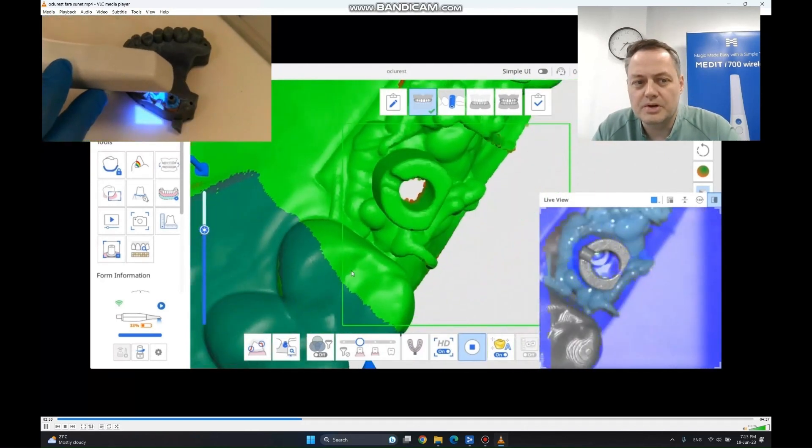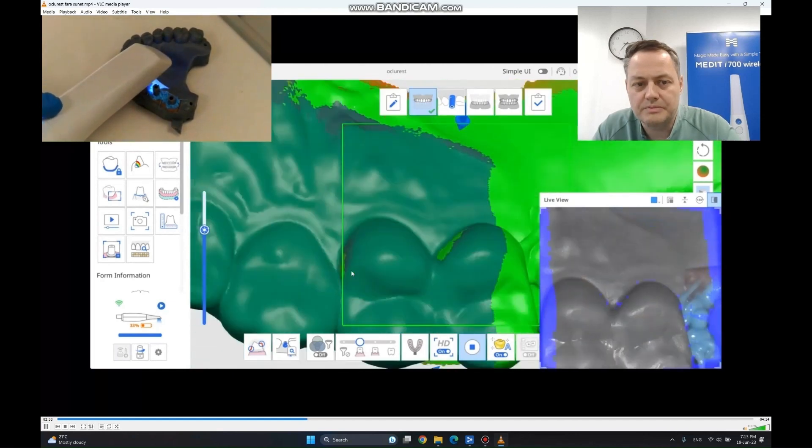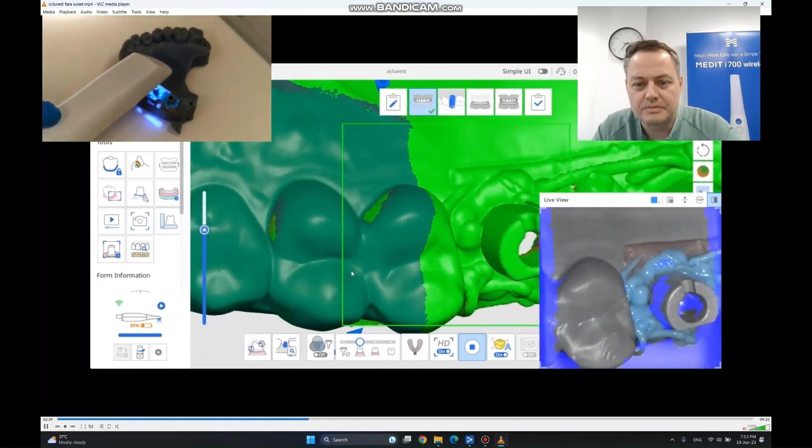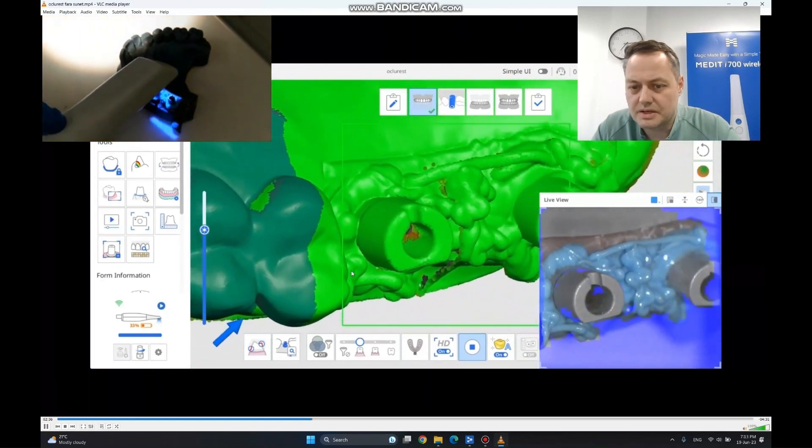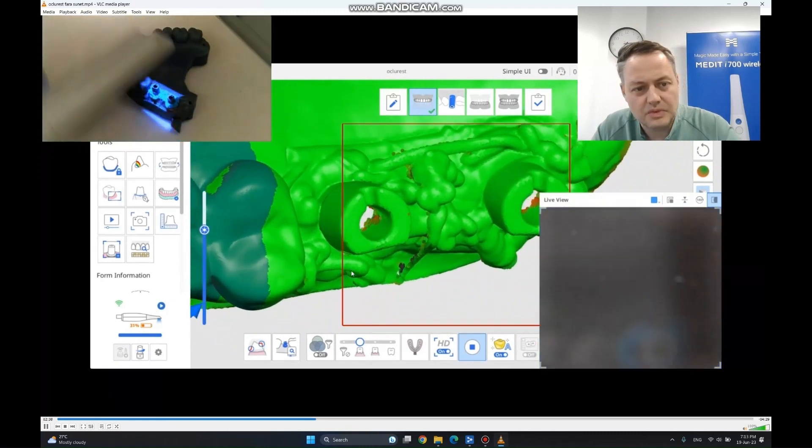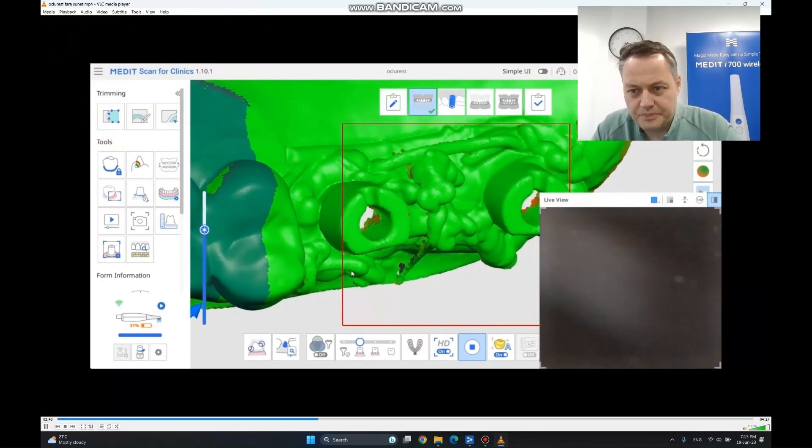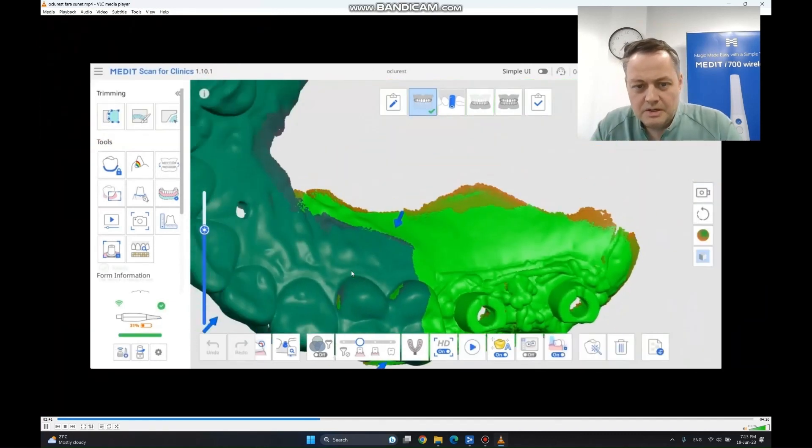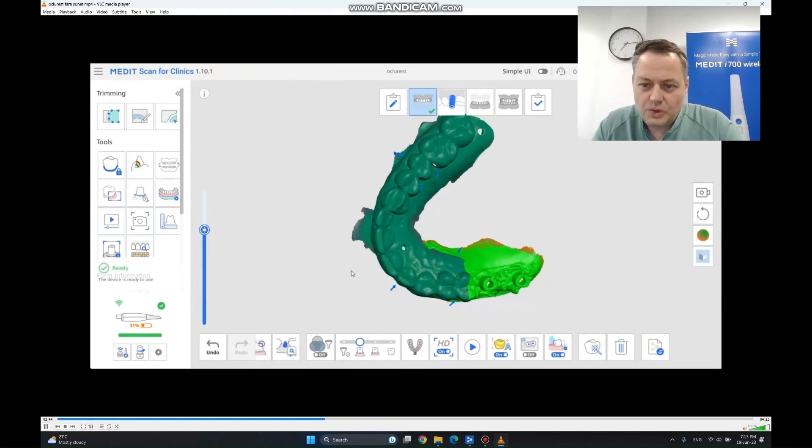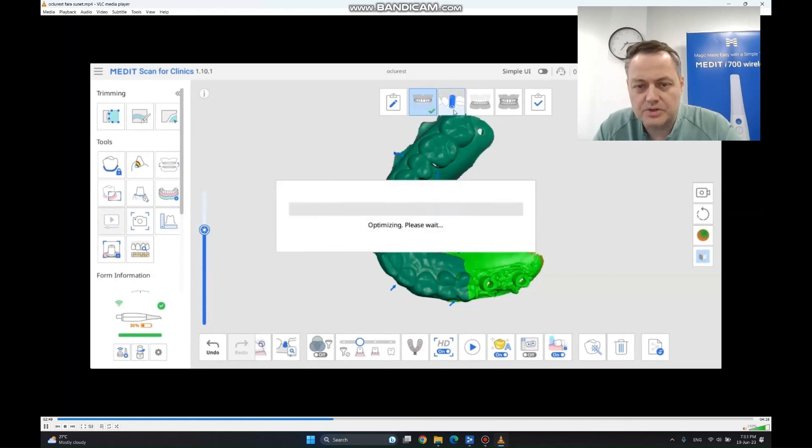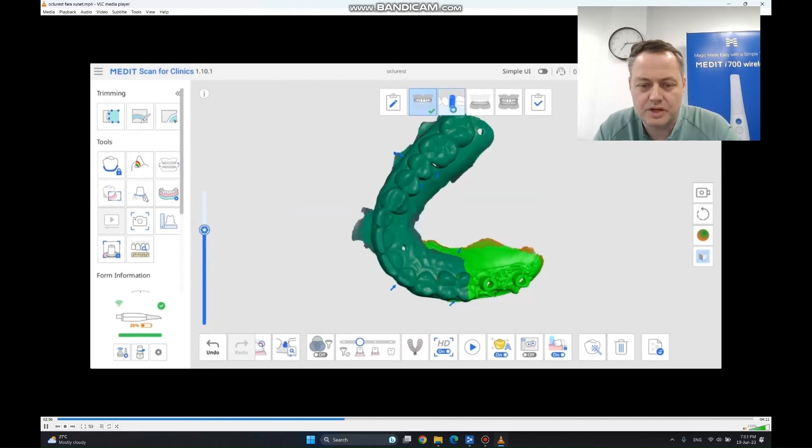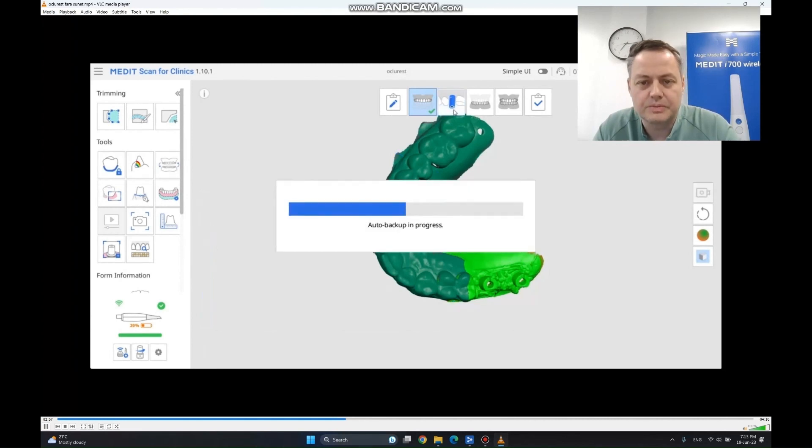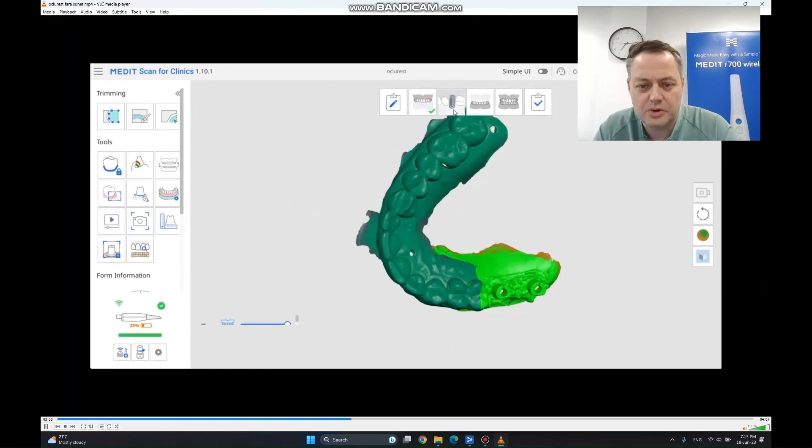We are going to put the scanner away. Right now we have everything that we needed on the scan body part. We are going to go in the scan body stage. We are going to import the whole maxilla that we just did with everything together. Please hit the optimize button. Don't forget the optimize button.